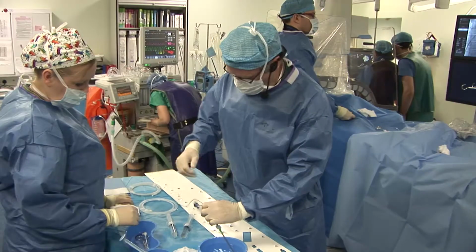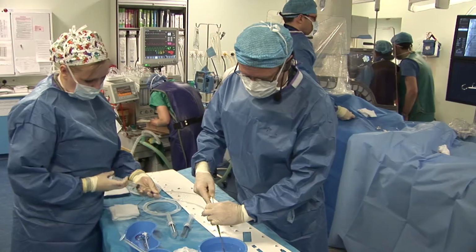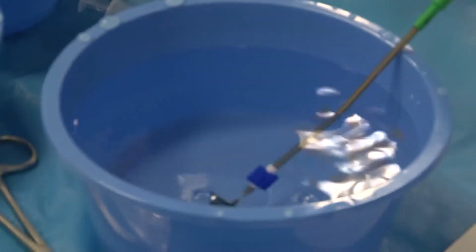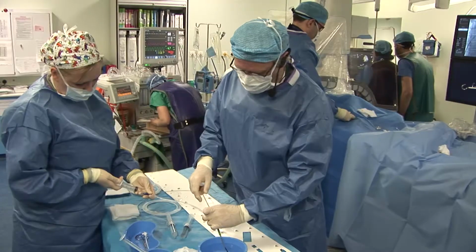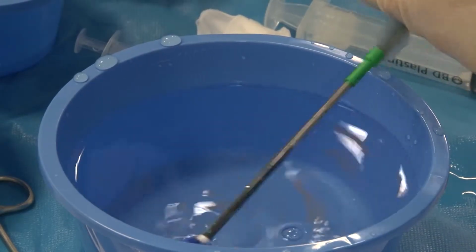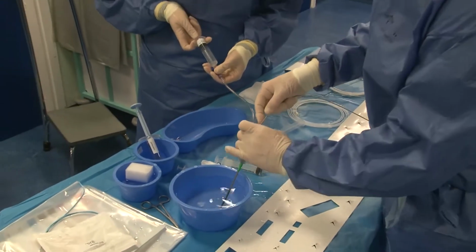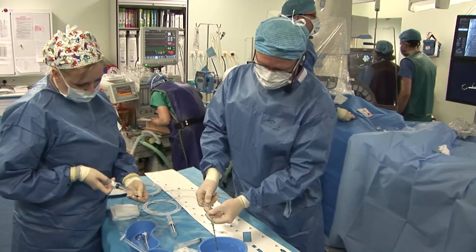So then, under the saline, I'll get you to do some flushing, Lisa. So we can just flush gently as we pull this back. Get the bubbles out before we do so, and then pull back. Okay. From this point on, we never aspirate, and just be careful that we never inject any more bubbles at any point. You can put your finger over the top, make sure that it's coming back.